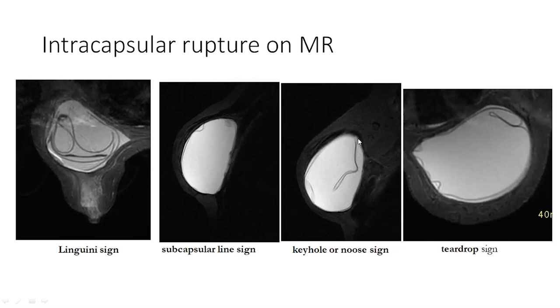The keyhole or noose sign is where we see this loop or noose of the silicone polymer capsule, and instead of the sides being adherent to each other with no brightness in between as we'd see on a normal radial fold, we do see bright silicone in between these two layers of the polymer capsule suggesting intracapsular rupture. Here we see the teardrop sign — this teardrop dot of silicone in between the silicone polymer capsule — as well as multiple subcapsular line signs, all consistent with intracapsular rupture of silicone implant on MRI.